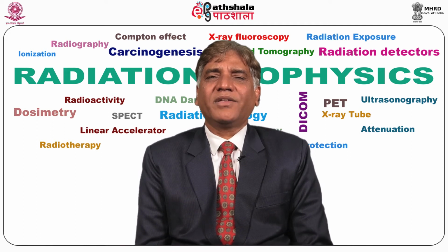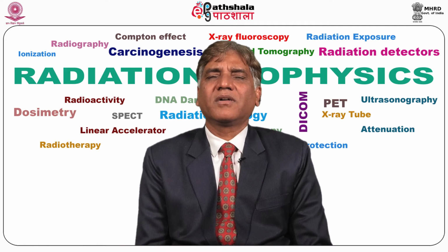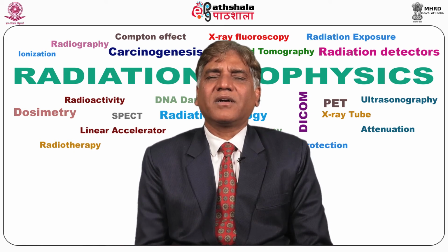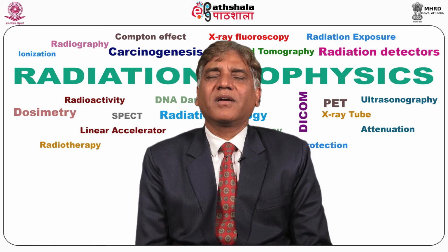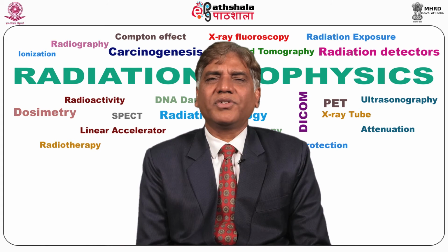The transducer is the device which produces ultrasound waves and detects the ultrasound waves. At first it acts as a transmitter, wherein electrical pulses are converted into ultrasound pulses, and these are sent out into the patient. When ultrasound waves interact with the body tissues, a portion gets reflected in the form of echoes, and these echoes are detected by the receiver, which converts these ultrasound pulses into electrical pulses again. The heart of the transducer is a piezoelectric element, usually lead zirconate titanate, PZT.